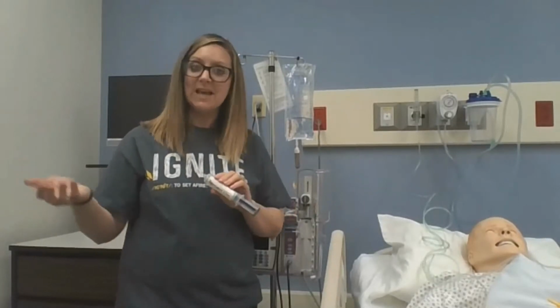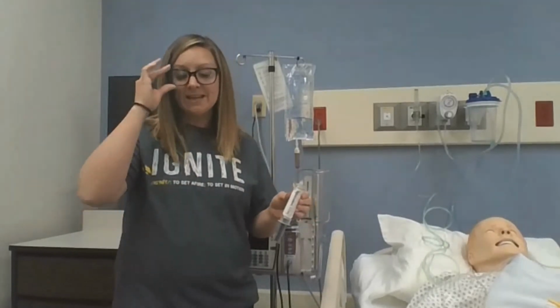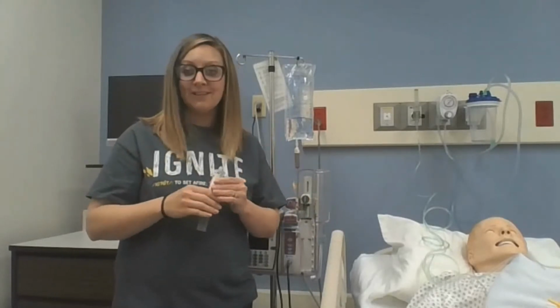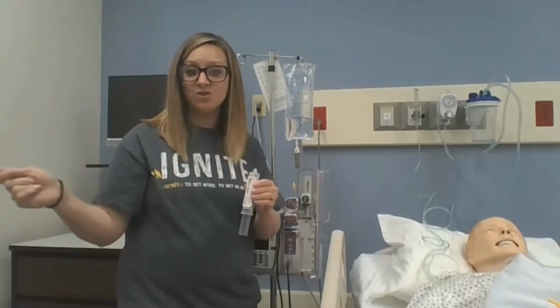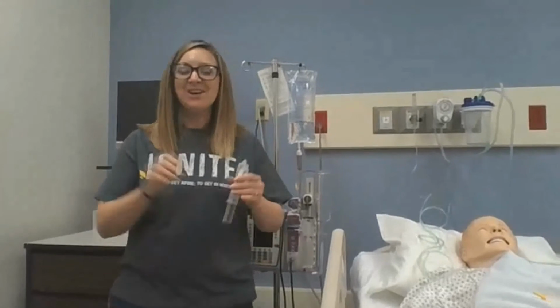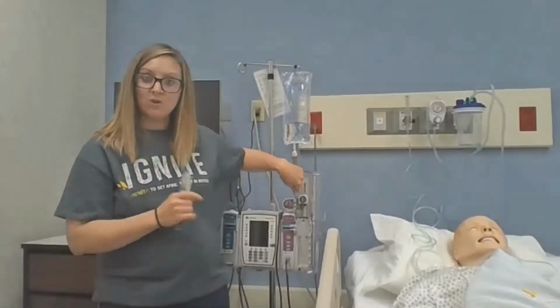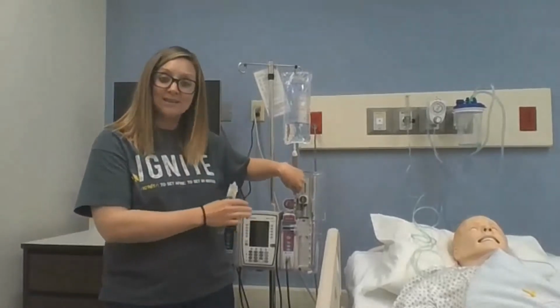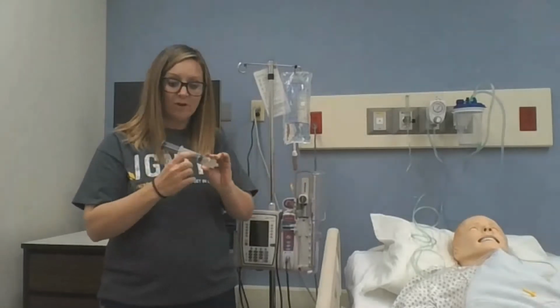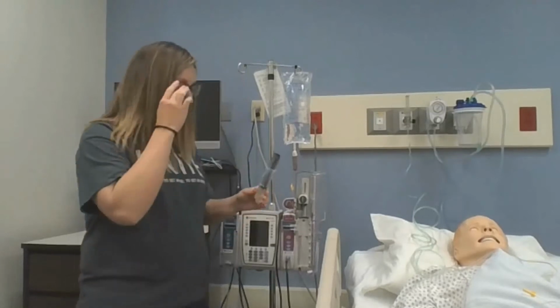And so either the pharmacy tech will bring it up, or in some instances, the nurse would have to go down to pharmacy and get it. If you're picking it up from pharmacy, it'll come with a yellow sheet of paper, which basically is a handoff sheet that says, hey, I am entrusting this nurse with the care of this 30 mL of Dilaudid. So you want to make sure that if you get one of those yellow papers, that you tuck it in and keep it with your drug, because that's where they're going to waste or report any waste at the end. If they discontinue the syringe before it's over, you're going to record any additional waste in there for that narcotic.